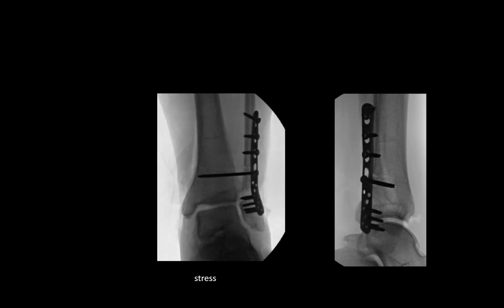Why does the talus look like it's angulated? Because we're stressing it to see if the syndesmosis widens. The syndesmosis doesn't widen, but because there's a soft tissue injury medially, the talus still tilts. Do you have a non-stress picture? It got deleted, sorry, that's why I said it's not there. At the end, that's why I put a suture anchor to just hold it down, because there was no capsule anymore attached. There was nothing, no ligaments anywhere.